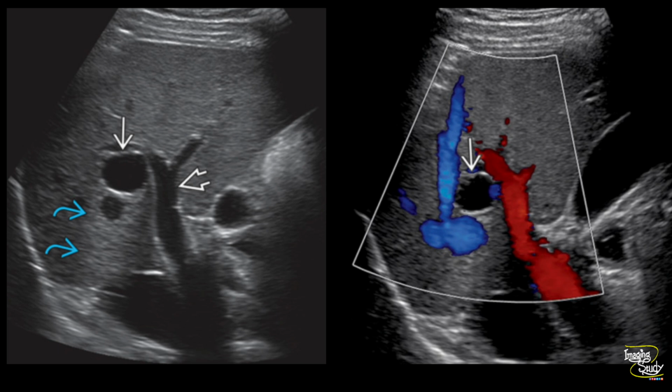Here you can see the portal vein, and adjacent to it there is a cystic area. You may miss it as a bile duct dilatation. This one is the gallbladder. We put the color Doppler and you can see there is an anechoic cystic area with no internal vascularity, indicating it as a cystic lesion.